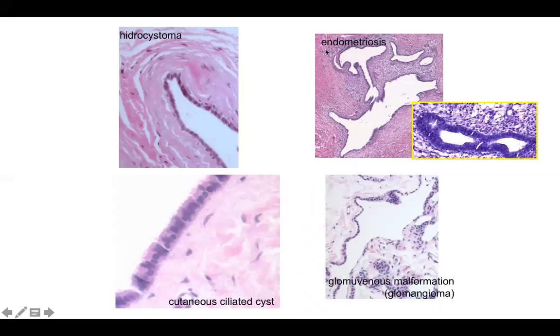Endometriosis has characteristic fibroblastic stroma with red blood cells. The cells lining the space are often rectangular and some may be clear.